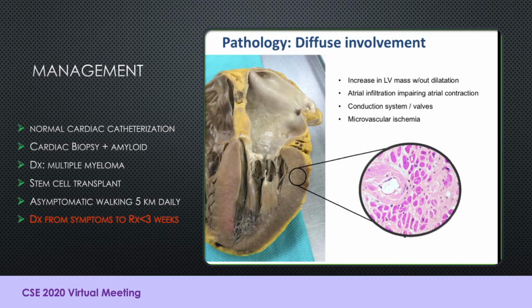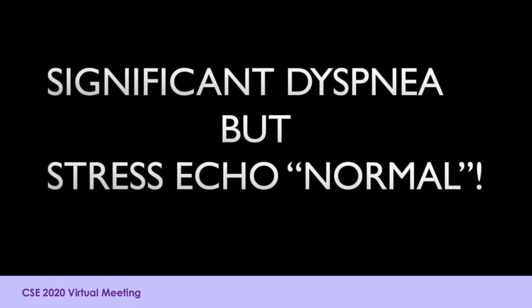So the time from symptoms to diagnosis was less than 3 weeks. So this is a very treatable disorder nowadays. I'd like to highlight again a normal stress echo with severe symptoms. In this case, it was dyspnea.